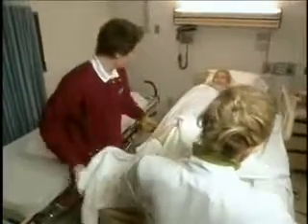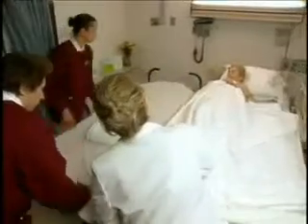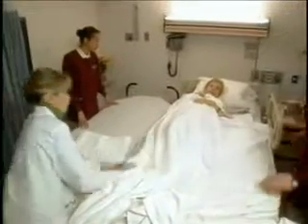All right. Now we can move the stretcher next to and parallel to the side of the bed. Make sure that the stretcher's wheels are locked. And the bed is locked. All right.